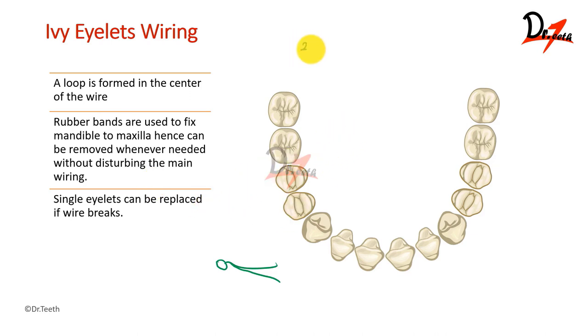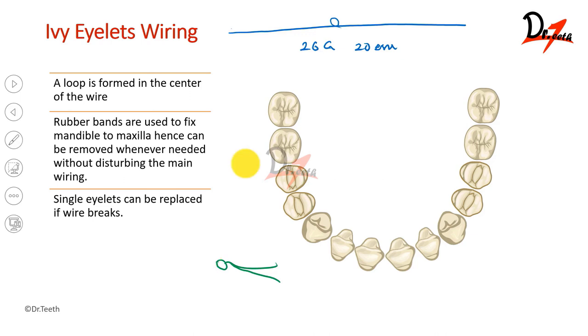Here we are taking a 26 gauge stainless steel wire, 20 centimeters in length. This is our 20 centimeter long wire. We have to make a loop at the center of this. We will be taking any instrument and then making this loop by twisting it around that instrument. Now we have the loop.